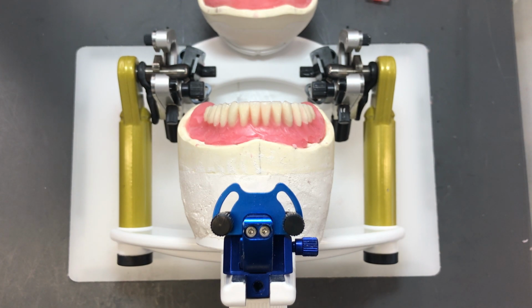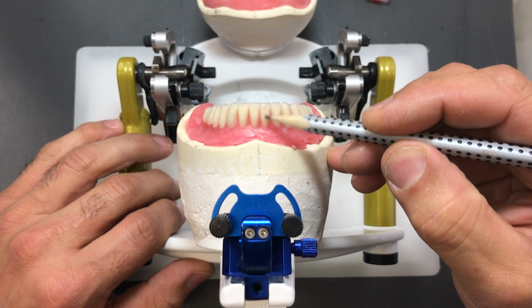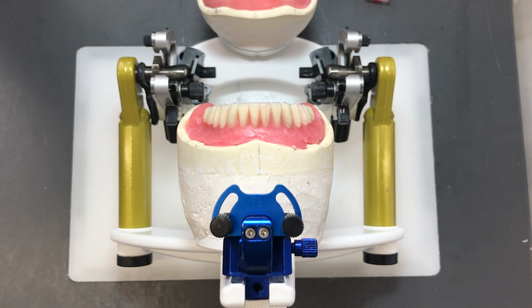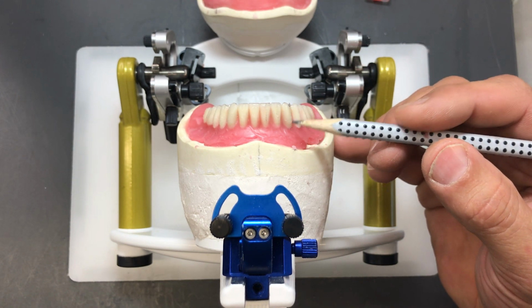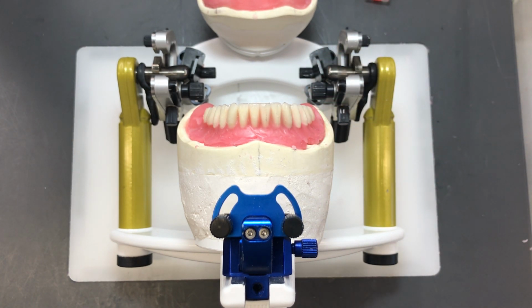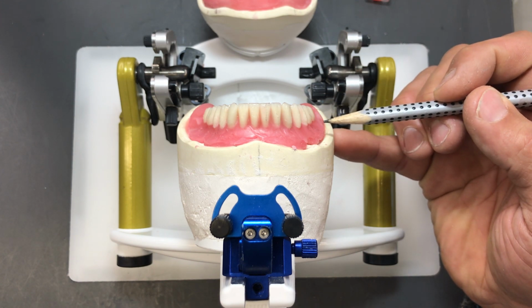The long axis of lower teeth have this slight distal inclination to it. Even though I trimmed them, they still do. There's a labial inclination of the centrals, but there's no labial inclination of the laterals. And in fact, when we get to the canines on either side, there's a lingual inclination, meaning that the incisal edge appears to be further lingually than the cervical third of the tooth in order to complement the buccal slope of the posterior teeth on either side.